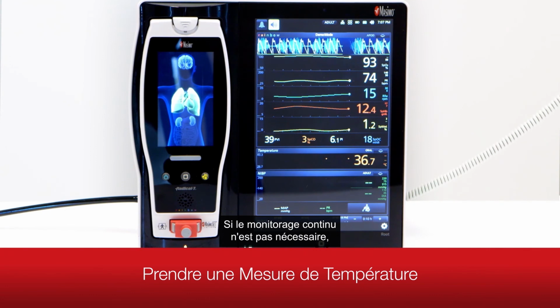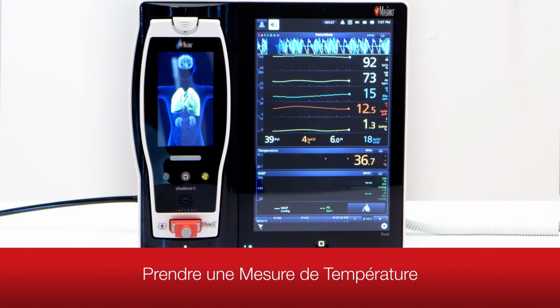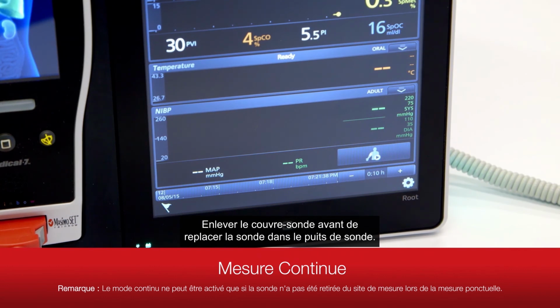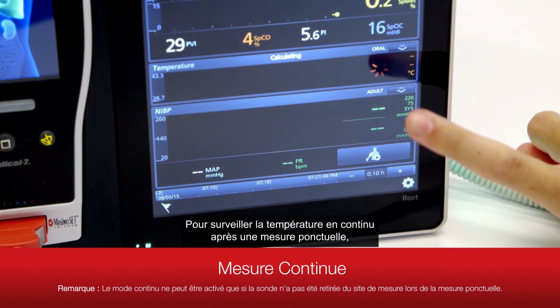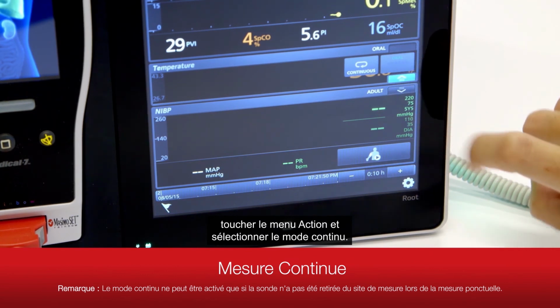If continuous monitoring is not needed, dock the temperature probe in the probe well to reset the measurement. Note: dispose of probe cover before placing probe back in probe well. To continuously monitor temperature after a spot check has been completed, touch the Action menu and then select Continuous Mode.